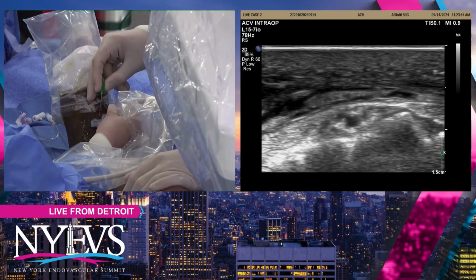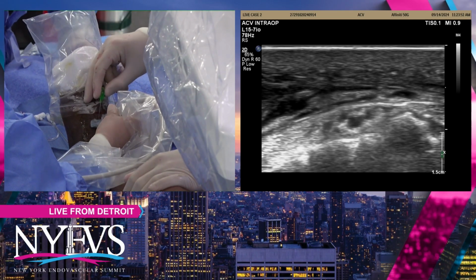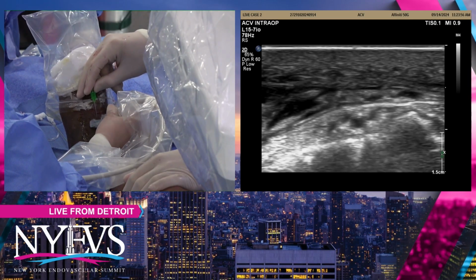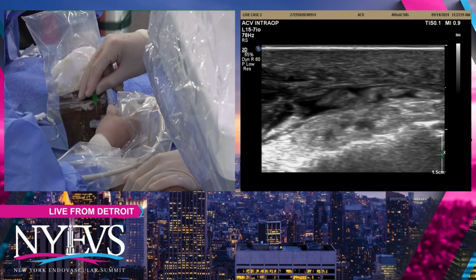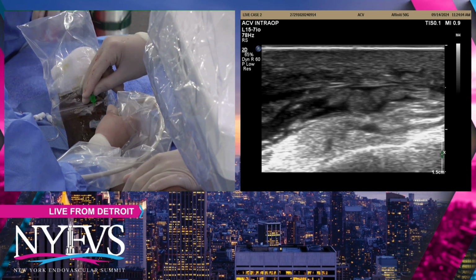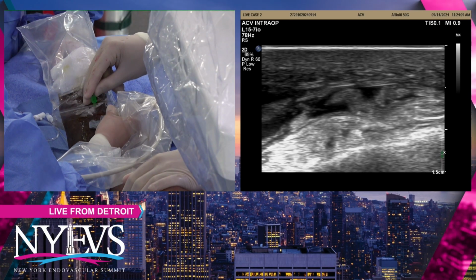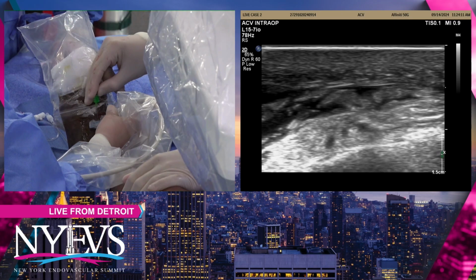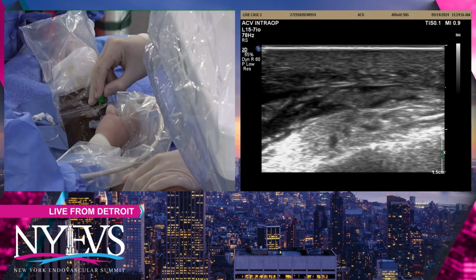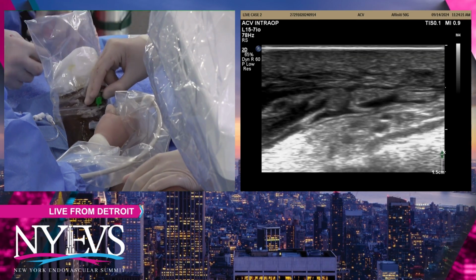Here comes a poke, dear. So I'm accessing close to the probe under ultrasound. And what I'm going to do is, there's no benefit to using ultrasound if I cannot see the needle. So I'm seeing the needle, I'm coming on top of the vessel. Without me talking to Caitlin, our interventional ultrasonographer, she moves away or she comes closer to me. So I'm on top of the vessel, and I'm going to apply sustained pressure, and she's already pointing to me that I'm moving to the left. So I'm going to adjust my vector a little bit, and then, again, apply pressure forward.